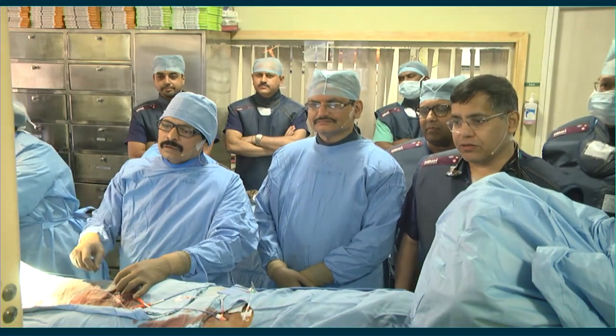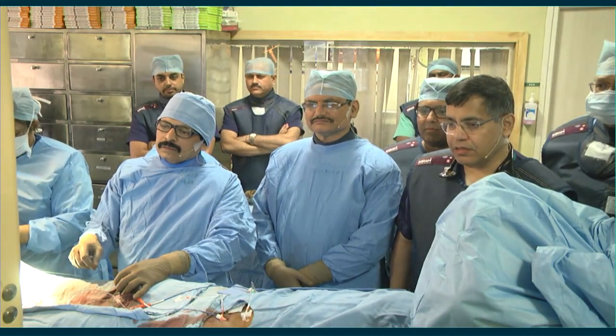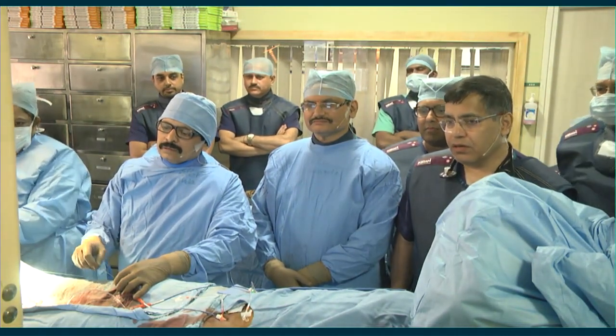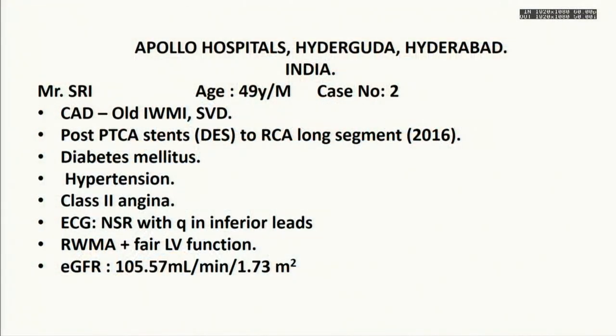From Apollo Hyderguda, India. Today's case is a 49-year-old gentleman who sustained an old inferior wall MI and was found to have single vessel disease involving his RCA.